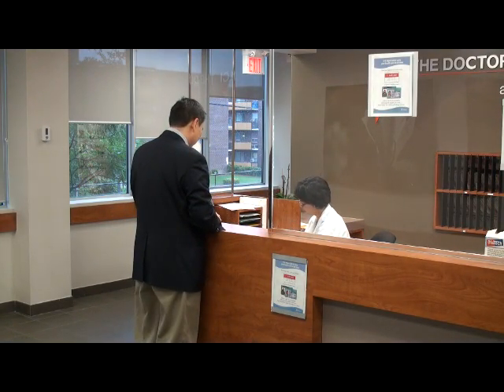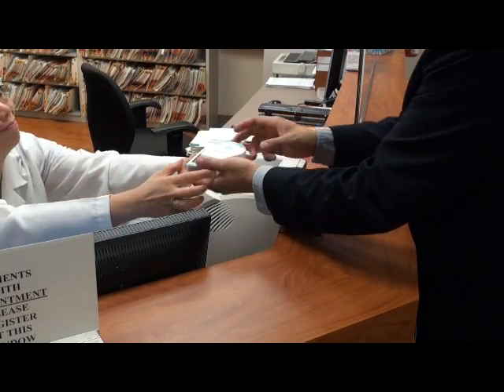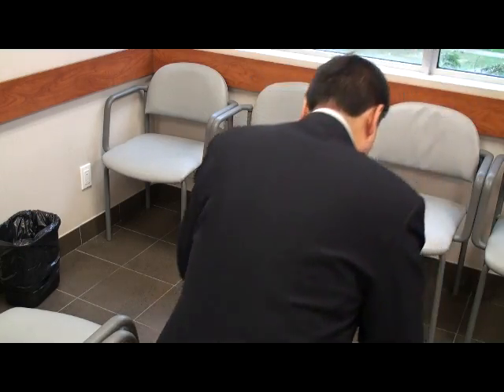Introducing the HeartCheck ECG monitor by Cardiocom Solutions, a device that allows patients to record and analyze their heart rhythm while waiting for medical appointments.